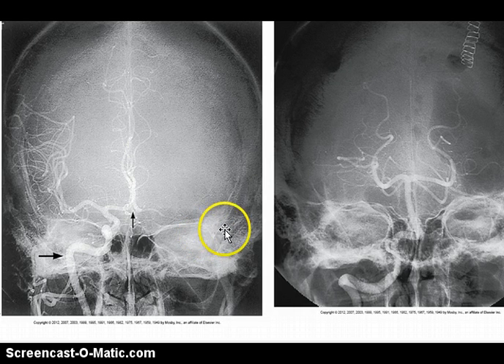Also, I want to note very quickly that for these AP views, you want the petrous ridges to be filling the orbits. The petrous ridges are a chunk of very dense bone in the head. They come off the temporal bone and jut in medially. You want the ridge of that bone to be superimposed over the superior rim of the orbit, one on top of each other, basically.